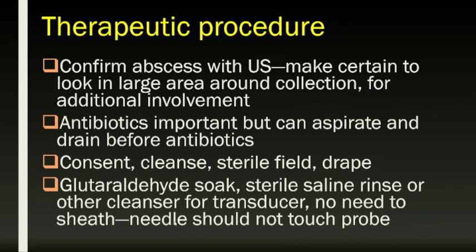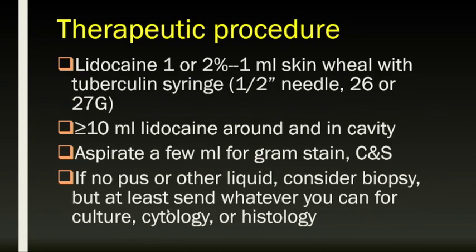You have a sterile field, and the needles, whatever needles you are using, should never touch the probe for any procedure. Lidocaine, 1 or 2%. 2% actually works a little bit better in these patients. Make a 1 milliliter wheel in the skin with a tuberculin syringe.